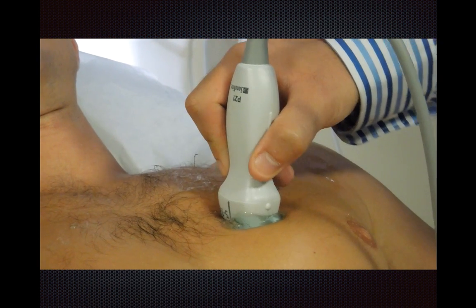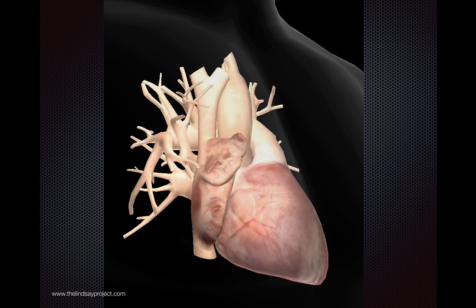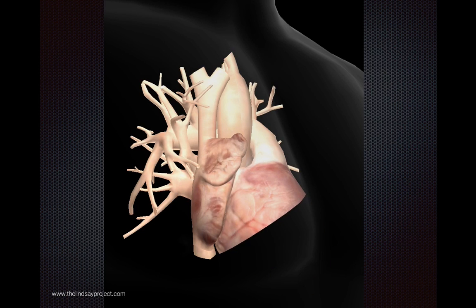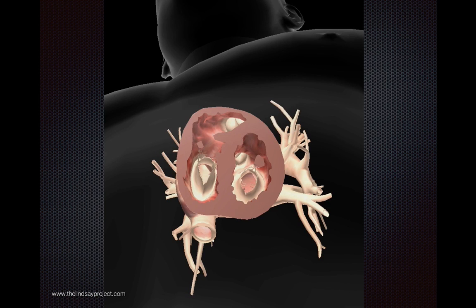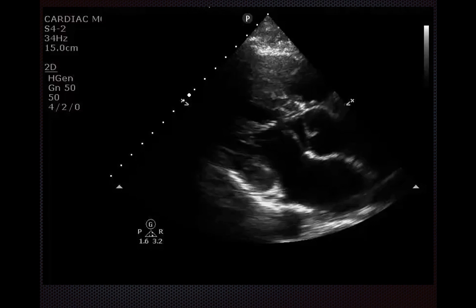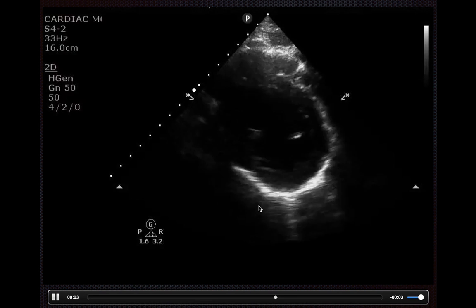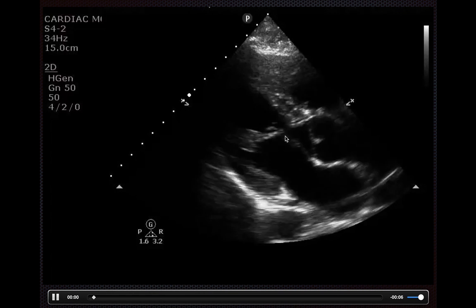That's what this would look like rotating it clockwise. Because you had it centered around the mitral valve, that would generally be the level you expect to see. Here we have the heart and we're going to do a cross-section, rotate that, and this is the view we're expecting to see. If you had it centered around the mitral valve, you'll want to scan a little bit lower to catch the papillary muscles. You can see we went from parasternal long axis to parasternal short axis right there, rotating and then getting the mitral valve in view.